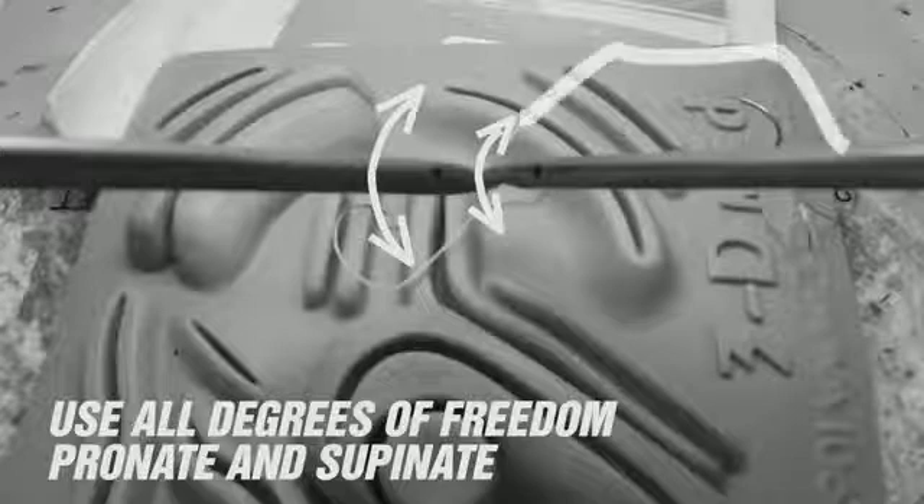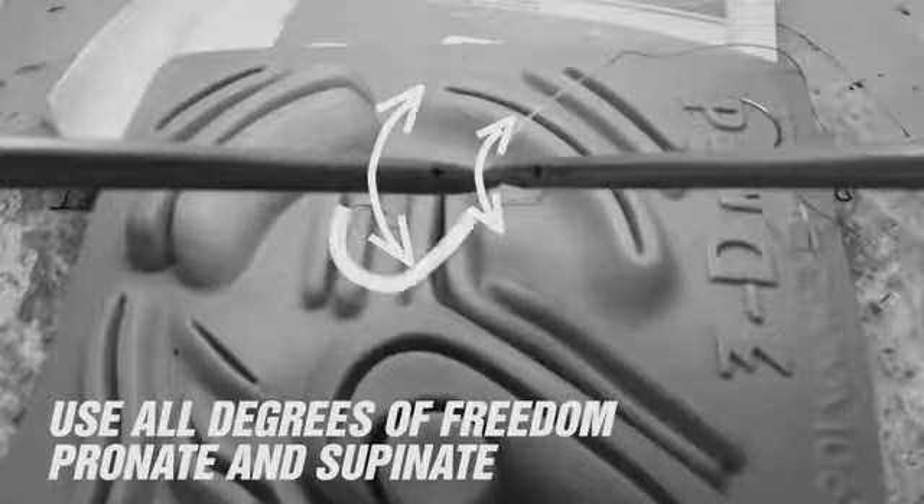If you gathered the suture above the equator as we have here, your tying instrument should begin tying the knot by going below the loop. This avoids the potential complication of trapping the needle end of your suture within the knot.